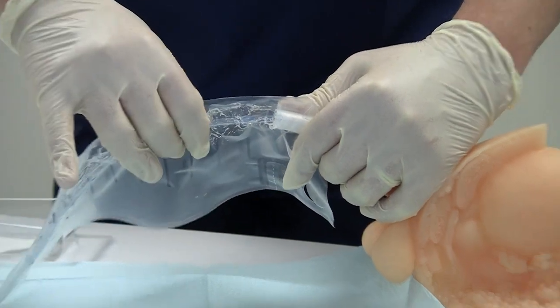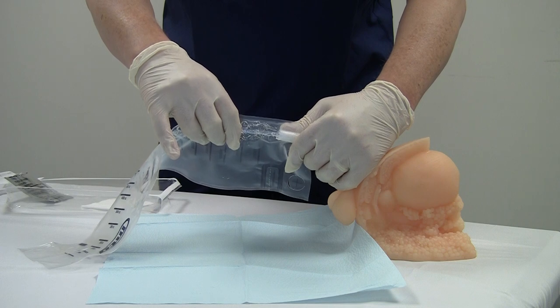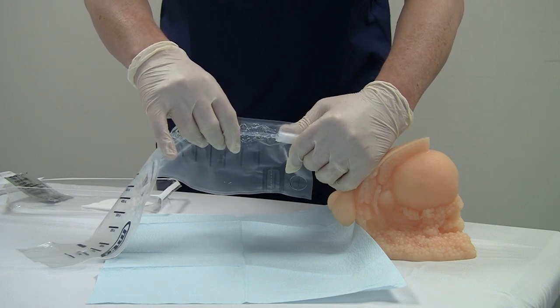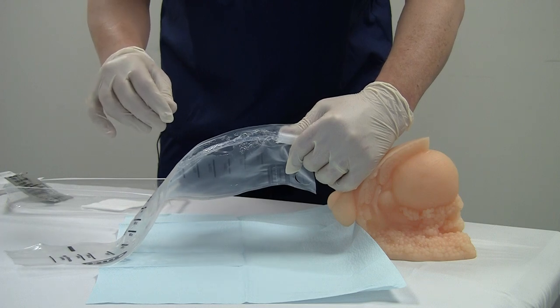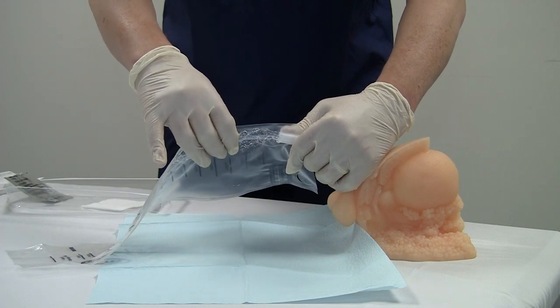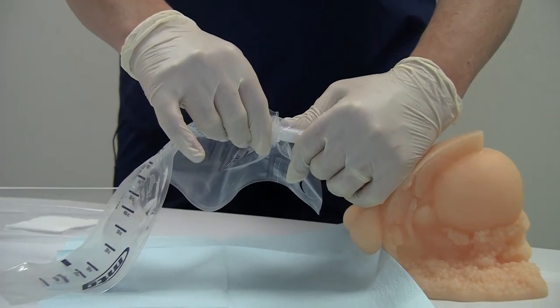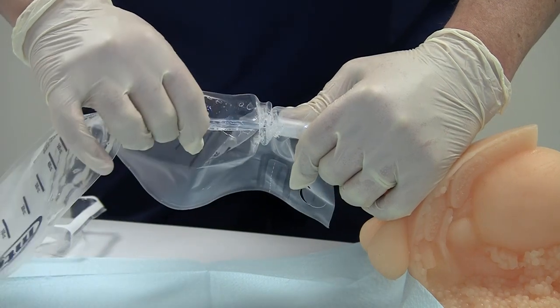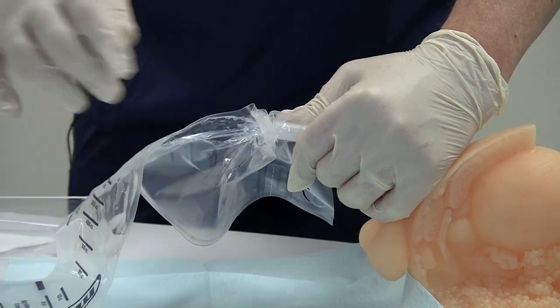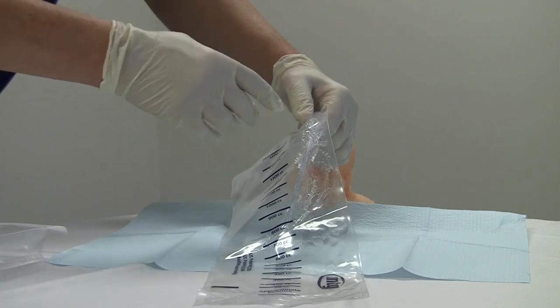Now let's assume that we reach the prostate and you're having a little trouble advancing the catheter further. If the patient's awake, you might ask him to take a deep breath, and certainly don't force the catheter in. Let's wait until we have a chance to pass the catheter without forcing it in. He takes a deep breath, we pass the catheter, one more push and get the catheter right in the bladder, and then one more push to get the catheter in the middle of the bladder, straighten the bag, and now urine will start to flow.